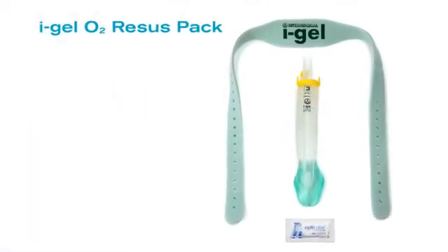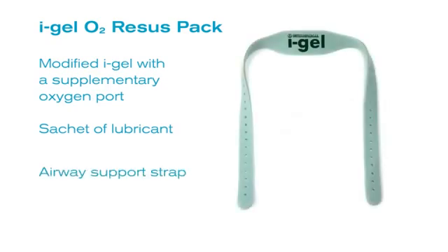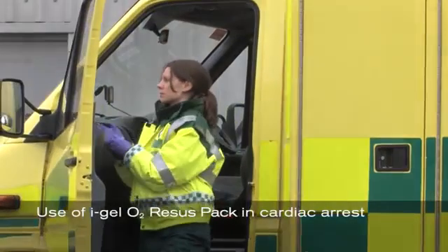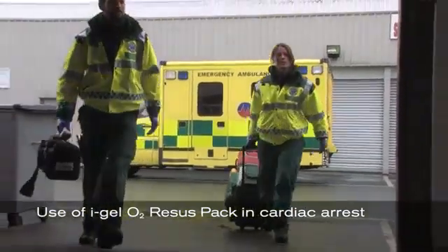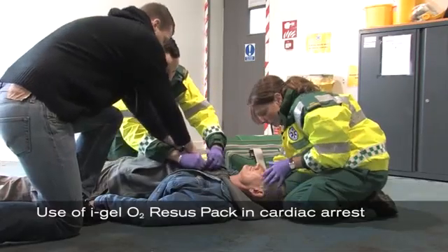The Eye Gel O2 recess pack includes a modified Eye Gel with a supplementary oxygen port, a sachet of lubricant, and an airway support strap, all contained within a sterile pack.